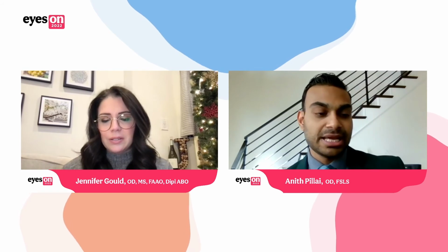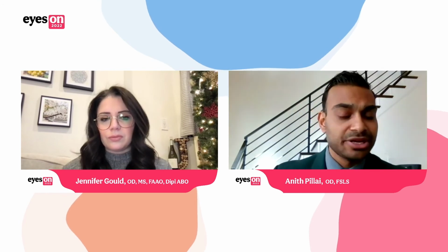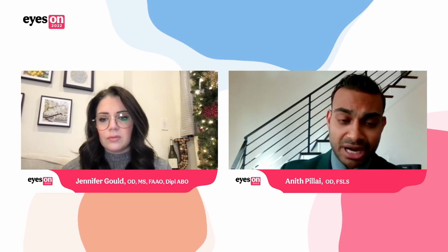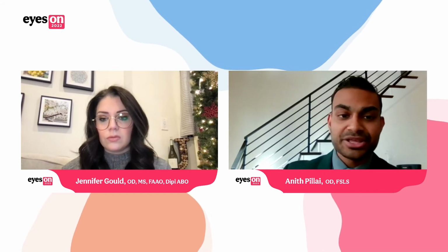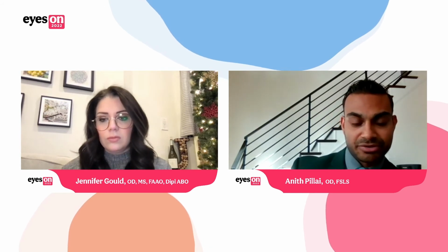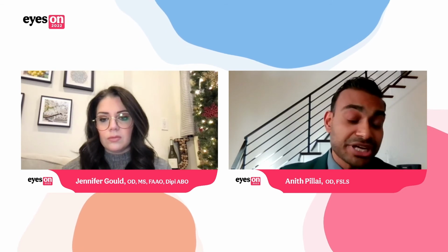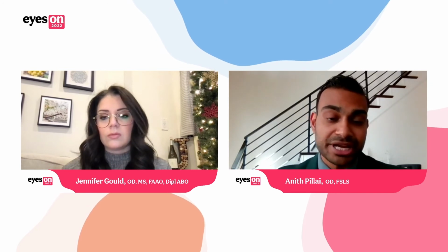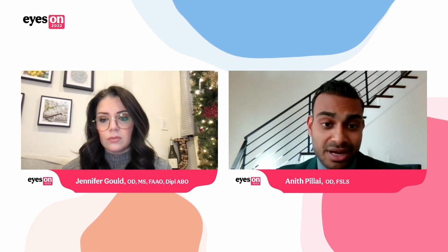That's such a great question, and I think I addressed it a little bit in the lecture. Definitely lateral decentration, whether it's temporal or nasal, is by far the most difficult one. And I lean a lot on my topography images, especially the difference maps. But for lateral decentration, I use a combination of my fluorescein capture at the slit lamp in addition to my topographical images. A lot of times, I would just make a diameter change. That's probably 90% of the cases: I went too small initially and I need to make an overall diameter change. But if I selected that correctly, I can go steeper or flatter on the alignment curve.